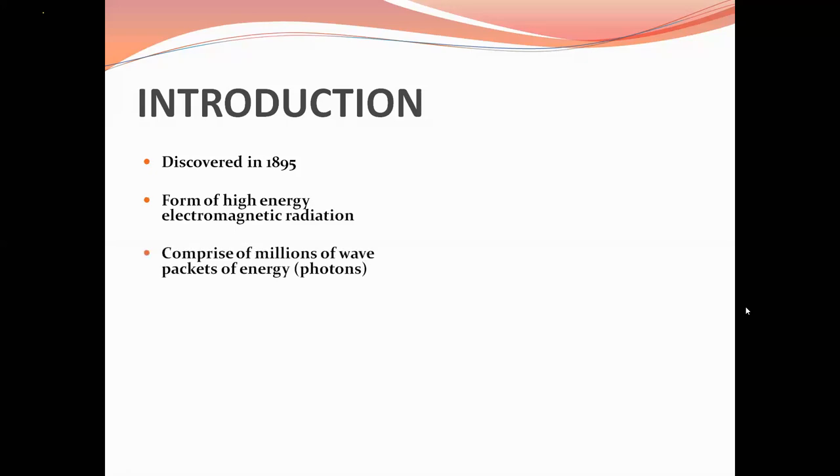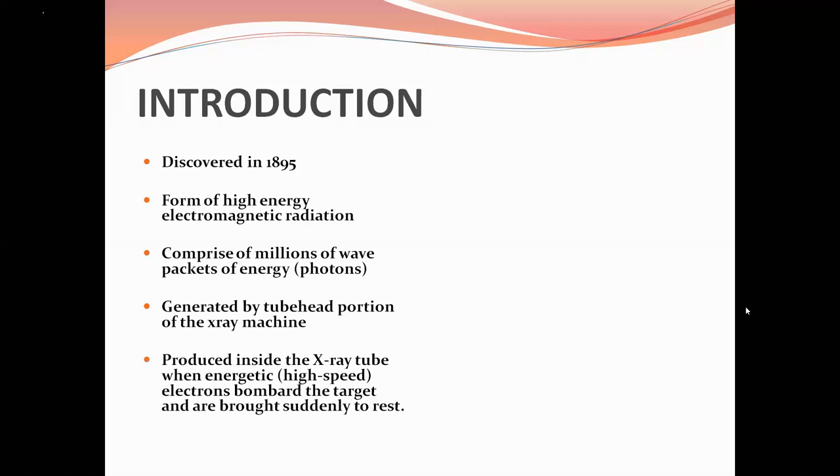Just to give you a brief introduction or a history of X-rays, they were discovered in 1895. They are a form of high energy electromagnetic radiation, and they comprise millions of wave packets of energy, which are called photons. They are generated by the tube head portion of the X-ray machine. When high energy electrons bombard a target, they are suddenly brought to rest, and all that kinetic energy of the electrons is then converted into X-rays.